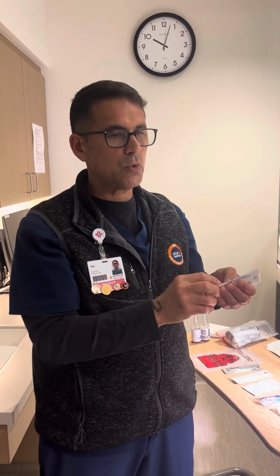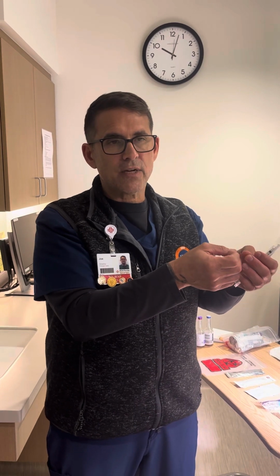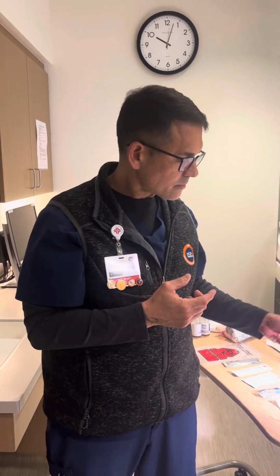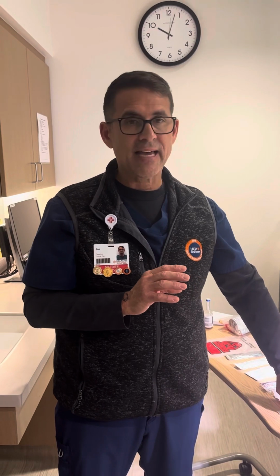You've hemolyzed your blood. So when you draw, you should be using the right size syringe, and the smaller the syringe, the less chance of hemolysis, because you can control the blood flow into the syringe better. If you have a big syringe, like a 10 ml syringe, even if you try to go slow, you may create some suction in there and hemolyze that blood. With a 3 or a 5 ml syringe, there's less of a chance of that. I would not draw blood from any line on a child with anything bigger than a 5, and that's if they have at least a really good vein on a 22 gauge or a 20.